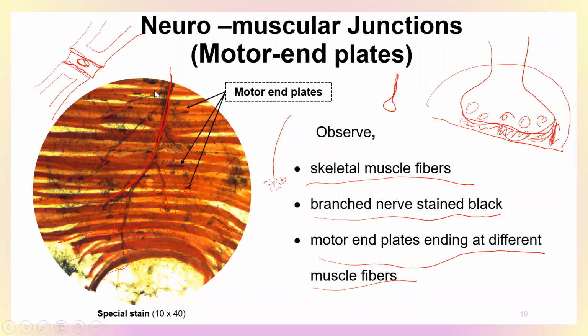Ground substance in connective tissue staining? No, not very clearly, because ground substance in anything doesn't stain clearly because it's just proteins, right? They don't stain well in H&E. If you want to look at the ground substance, you can do special stains. In articular cartilage, the ground substance is specifically stained with a stain called safranin, right? The intensity of that stain also tells you whether there is a lot of protein in that matrix or less protein. So it doesn't really stain in H&E that much.